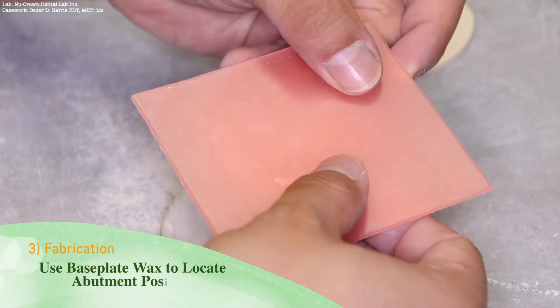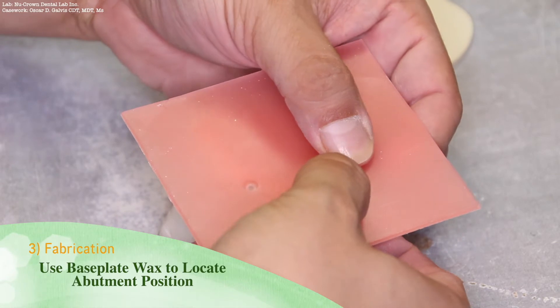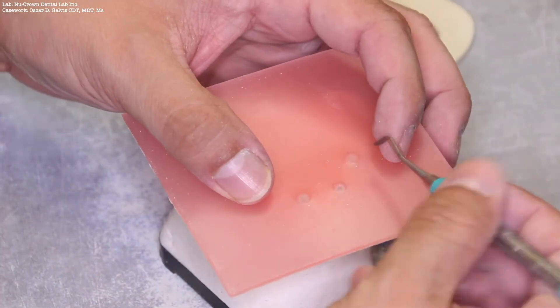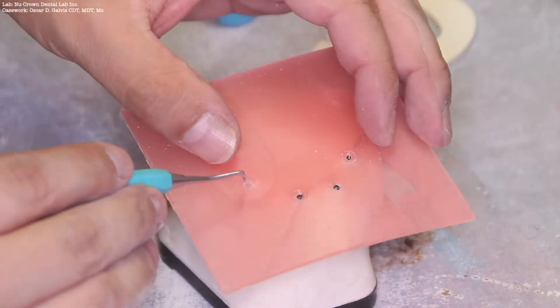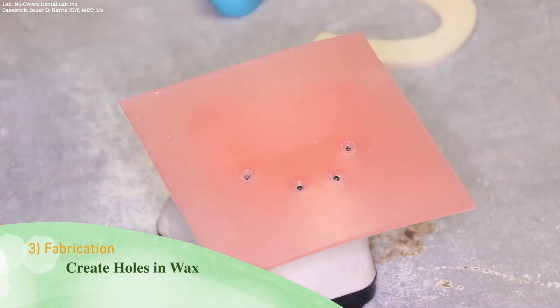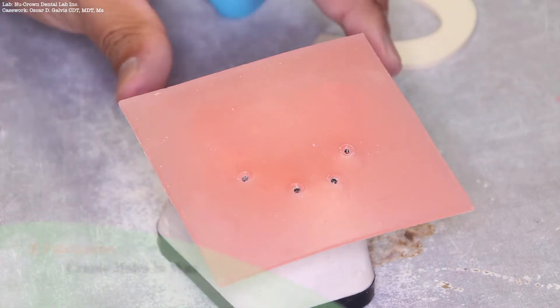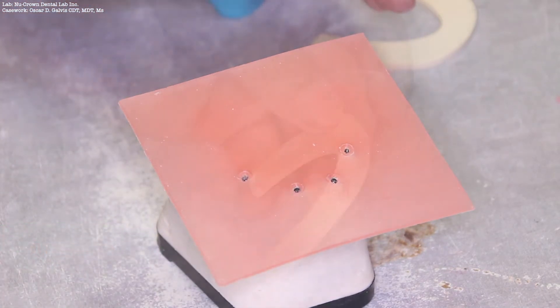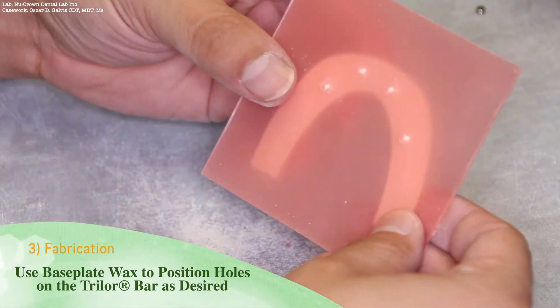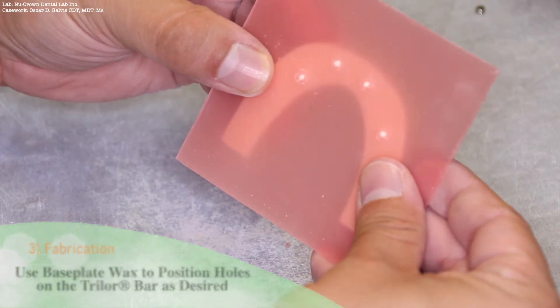Next, take a sheet of hard baseplate wax and press it down on top of the abutments. This will help in locating the abutment position on the Trilor substructure. Be sure to create holes in your baseplate wax. Once the holes have been marked on the baseplate wax, use the baseplate wax to position the holes on the Trilor bar as desired.